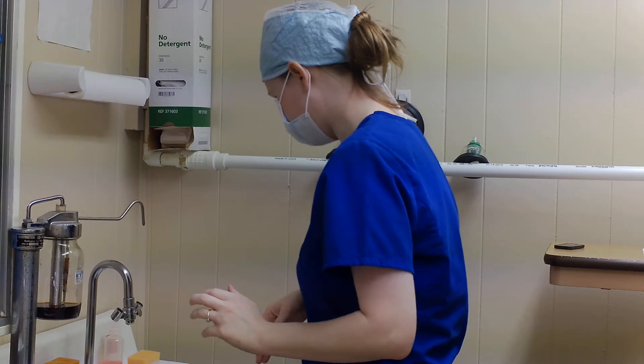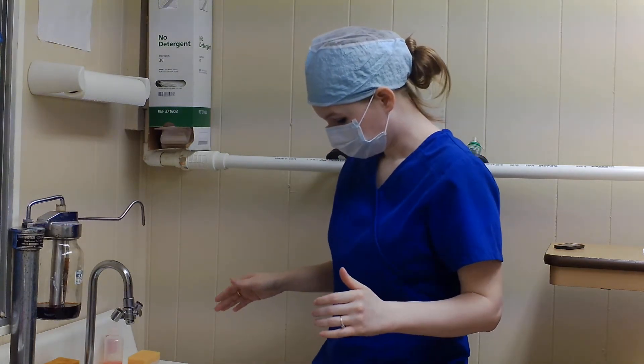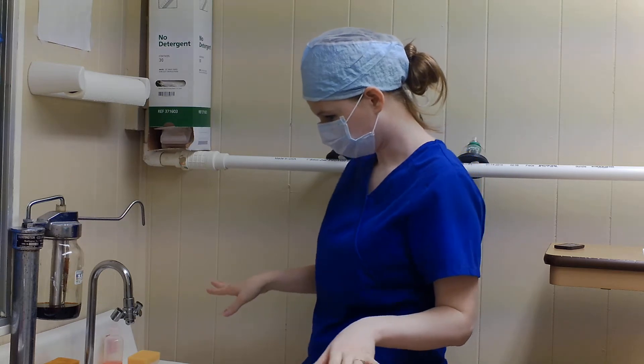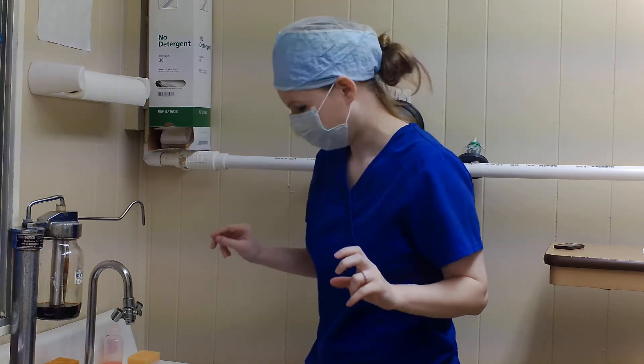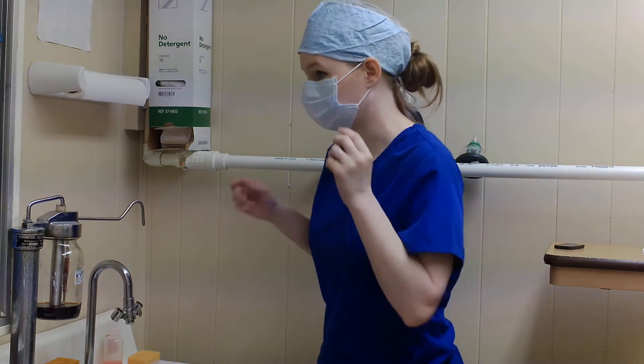We have a leg-powered faucet, so I can just press on it. I don't need to worry about wasting any water.